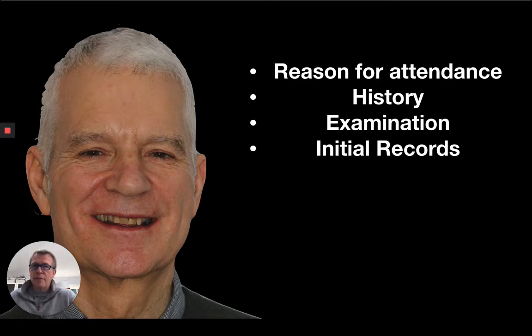Once we've done this, then we could maybe take some initial records. Initial records would be photographs. I still think photographs are a great way of communicating. We could take, maybe it's part of your schedule to take some scans or impressions. So certainly in the digital world, I am encouraging people to look into scanning, but we can still take impressions or cast models and then have them scanned and get into the digital world in that way.